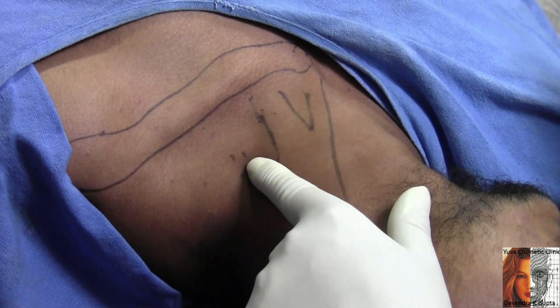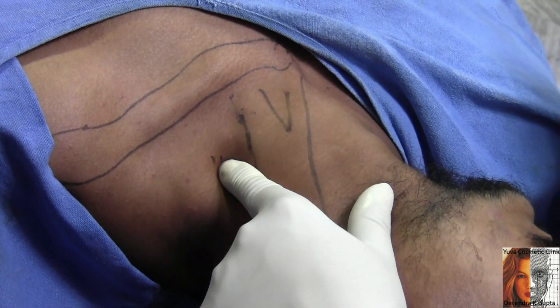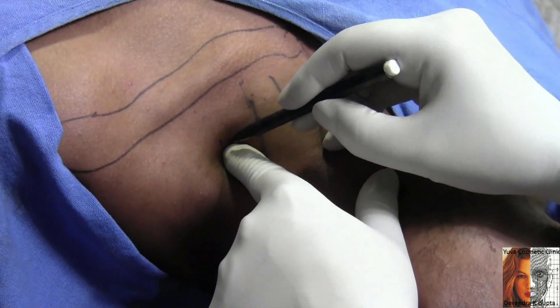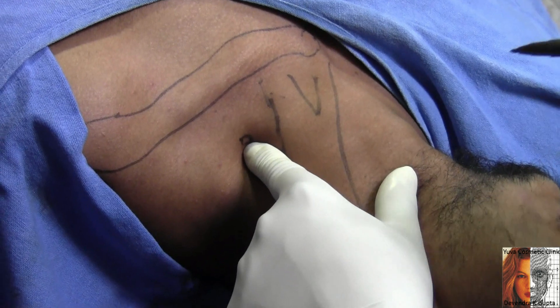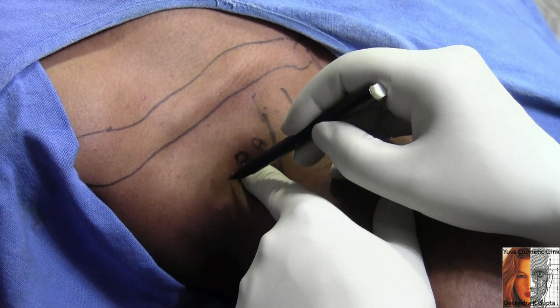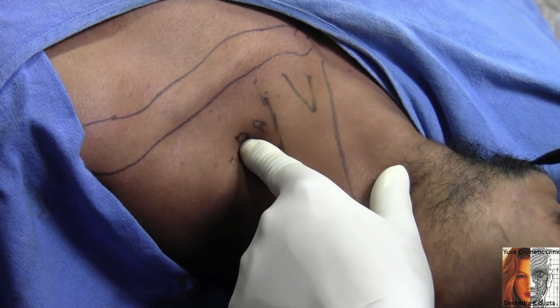Now here I can feel a groove. This is the scalenus anticus, scalenus medius, and this is the interscalene group. I have marked a circle here. My finger is exactly in between the scalenus anticus and scalenus medius. There is a cleft — this is the interscalene cleft.